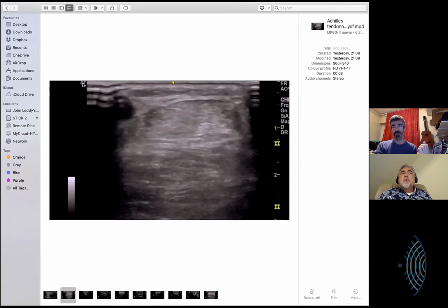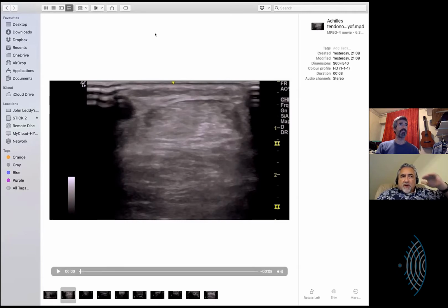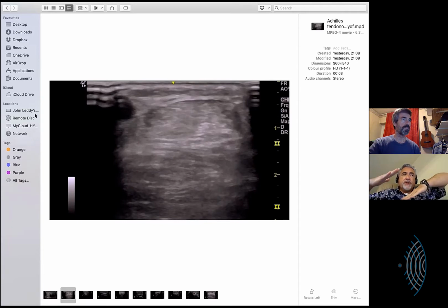What you just said needs to have some context with it, and I'd love to have you find those. I think what I heard you say is that as you watch the Achilles tendon start to thin out, it will look like a single layer of bright tissue, and that homogeneous bright tissue will give way to where you'll see an interface, almost making it look bilaminar, and the lower tissue would, I'm going to guess, be gastroc.